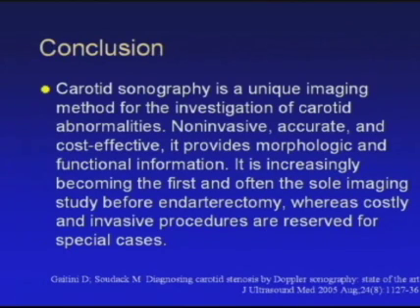Finally, carotid sonography is a unique imaging method for the investigation of carotid abnormalities: non-invasive, accurate, and cost-effective. It provides morphologic and functional information. It is increasingly becoming the first and often the sole imaging study before endarterectomy, whereas costly and invasive procedures are reserved for special cases.